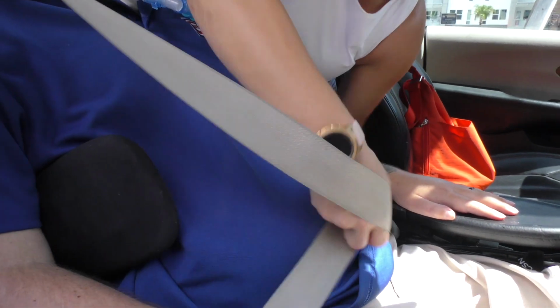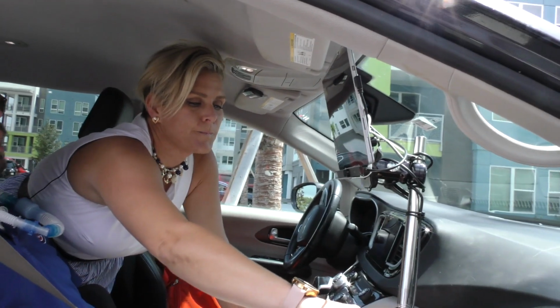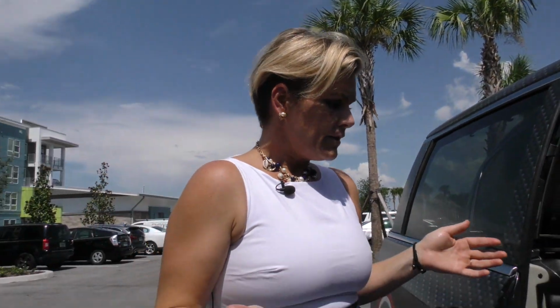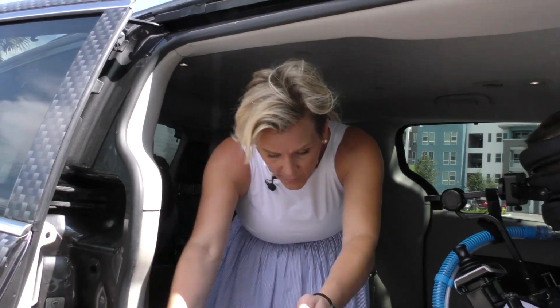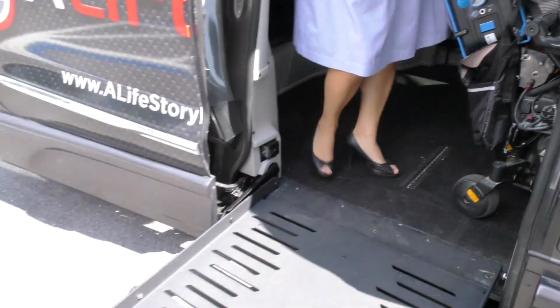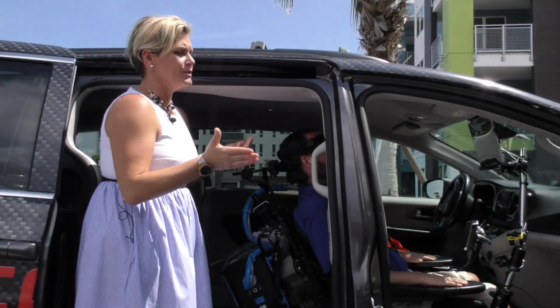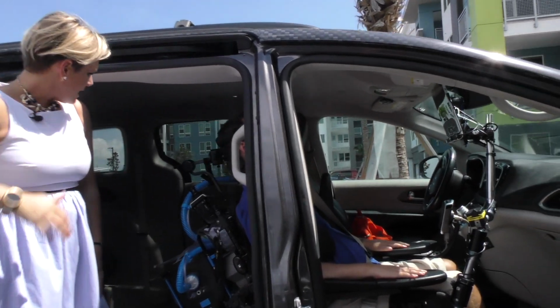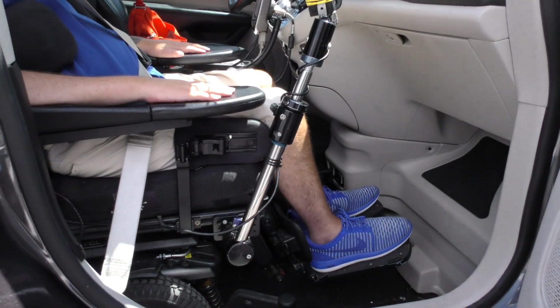And we also turn his speaker off, and that will connect him to the radio. Over the years we have learned that backing him up the ramp has been easier because then we can just turn him around. At first we would always drive him in frontways and then try to turn. So I guess it depends on how you feel comfortable maneuvering him through that. That was a pretty good learning curve. And getting him locked into place is a lot more difficult than you would think.